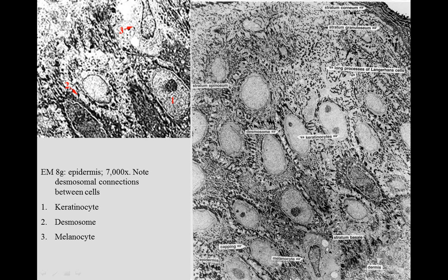And then in the basal layer, you have cells that proliferate. Here's a melanocyte that produces pigmentation for the cells. Here we see some capping going on, but the point here is that stratified squamous epithelium is a protective type of epithelium that resists mechanical stress.